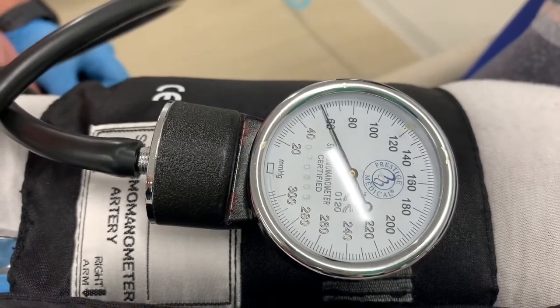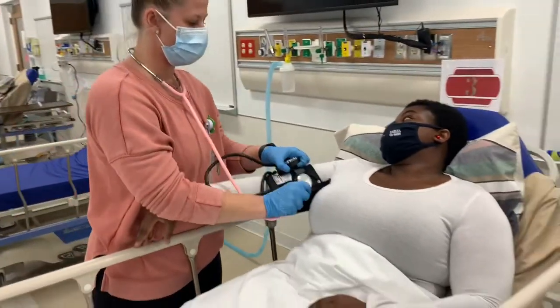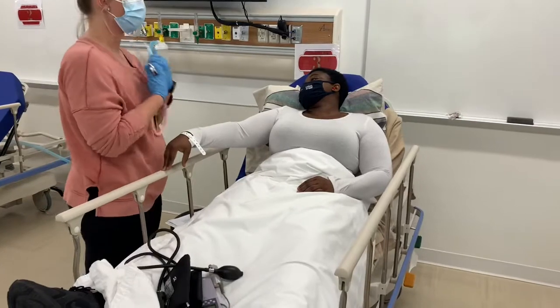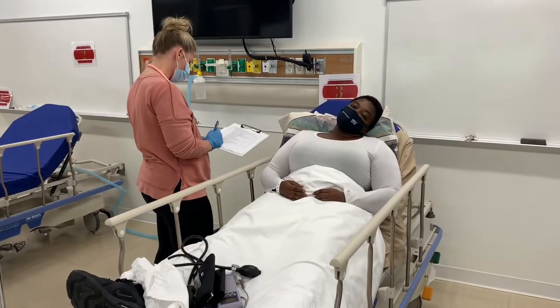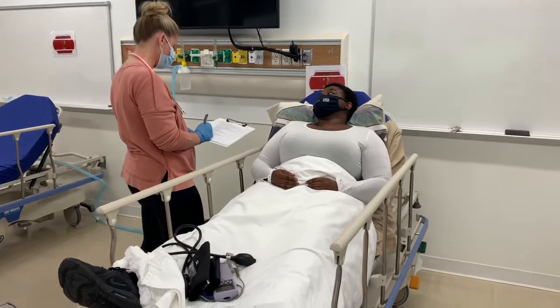Remember to open the valve slowly so the number doesn't drop quickly. Remove your equipment correctly. Correctly record the blood pressure in your patient's chart. Her blood pressure was 128/74.